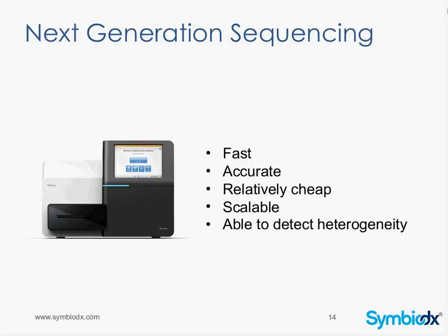So by scalable, what I mean is we can look at just targeted sequences like we look at in our assay currently. We can look at the entire exome, in other words, the entire coding region of the genome, or we can look at the entire genome. So we target it to the use that we need it most for.